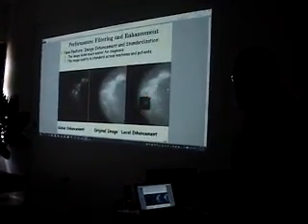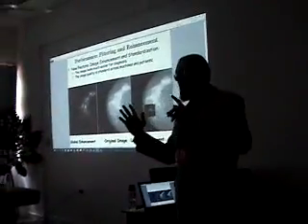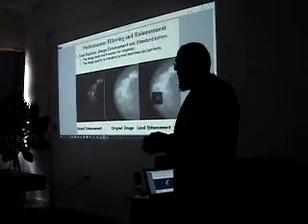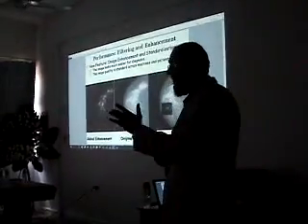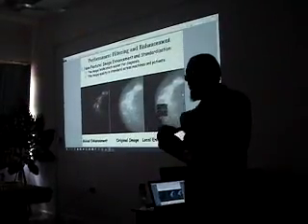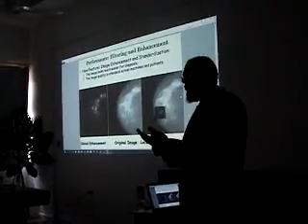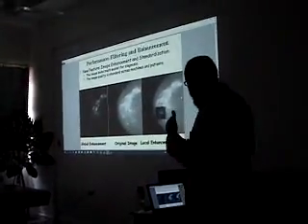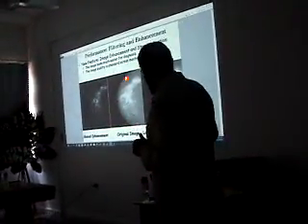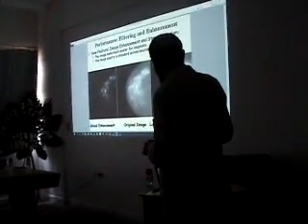And this is the third functionality of LibCat. As we recall, we said LibCat has 3 functionalities: number 1, mass detection; number 2, microcalcification detection; and image enhancement. Image enhancement is an aggressive filter that filters the image so that a radiologist can diagnose and investigate the image just by eye. It does not need automated detection. So this is, for example, an image without aggressive filtering. This is after applying the aggressive filtering of LibCat.